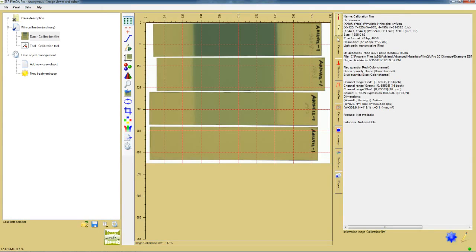However, we advise adding 1 or 2 extra points, since that allows calculation of statistics to show the goodness of the fit, and this helps in selecting the best fitting function, as well as to see if a dose point is in error.